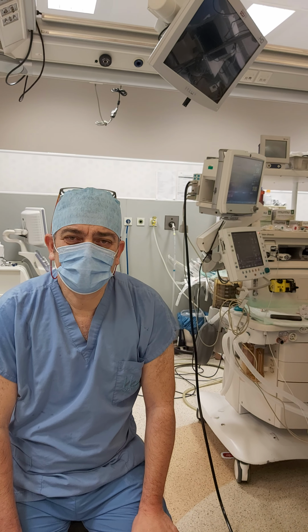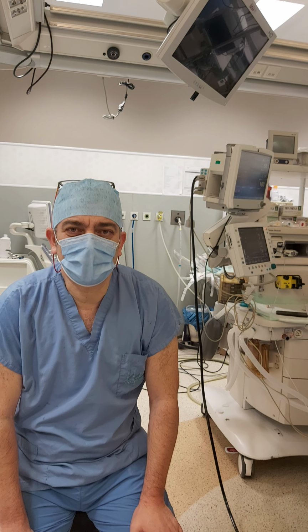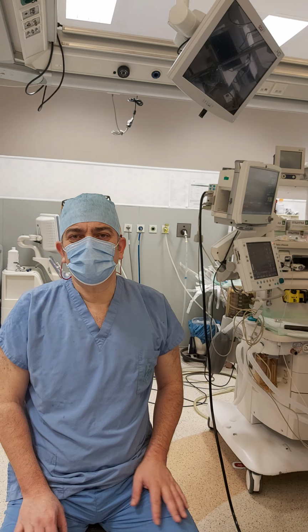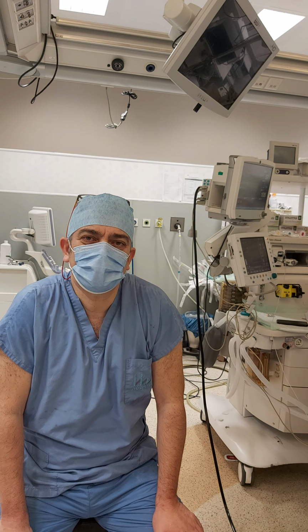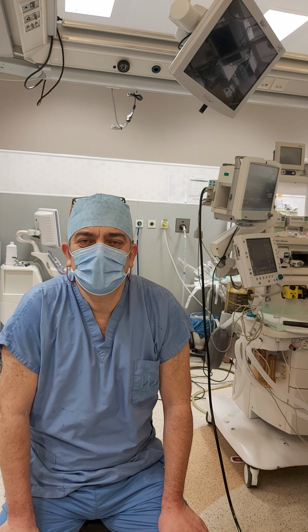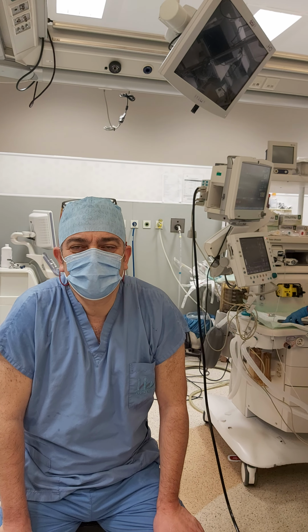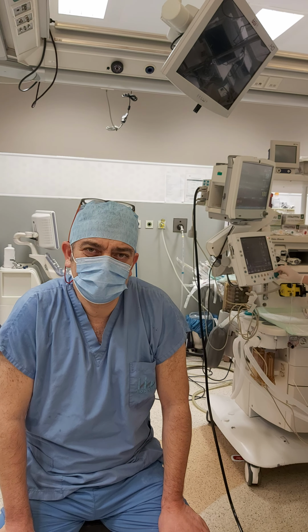So I was not sure about the procedure that was done to her, so I wanted her to come and let me look inside. In her cystoscopy films, I noticed that there were some areas of improper or insufficient fulguration. So we made the fulguration again, we made the cystoscopy.